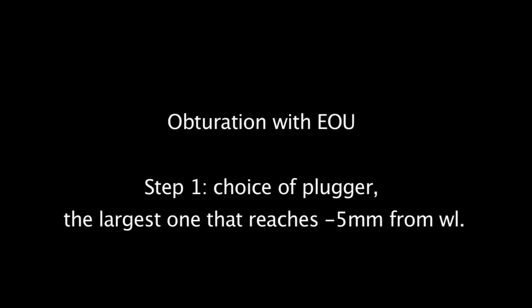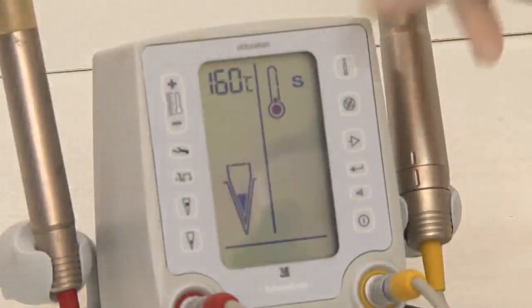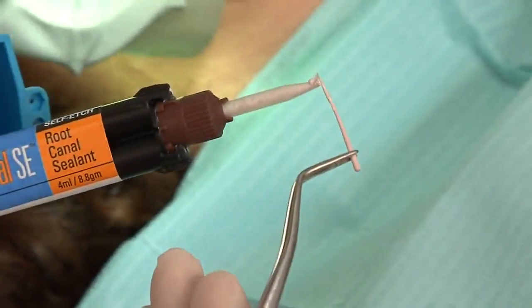It's time to go to obturation using the element obturation unit. Step 1 is the choice of pluggers — the largest plugger that will reach minus 5mm from our working length. We try them first, with the palatal cusp as our reference. We switch to S for synthetic ReSeal, and the temperature is set to 160°C for the down pack. We put a coat of sealer on the master cone. I switch on the filter light on my microscope to avoid any chemical reaction or light curing of the sealer.